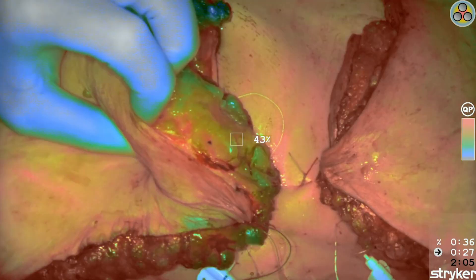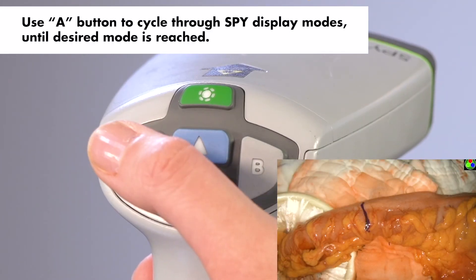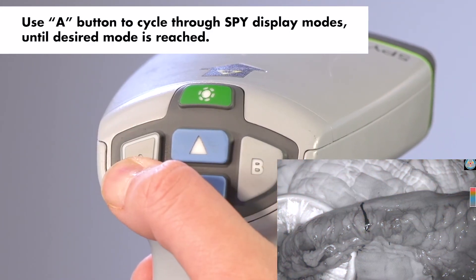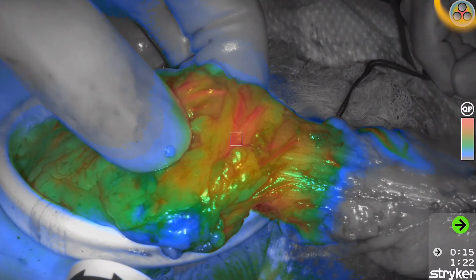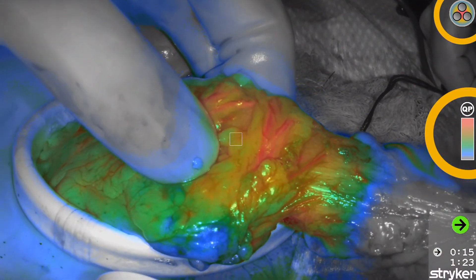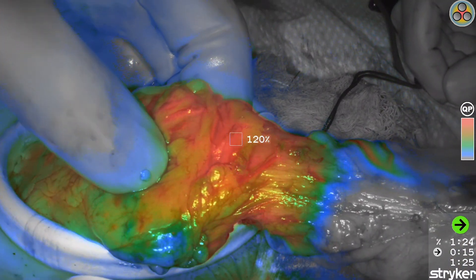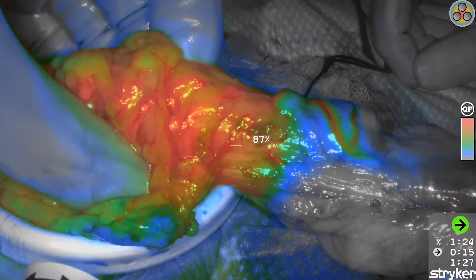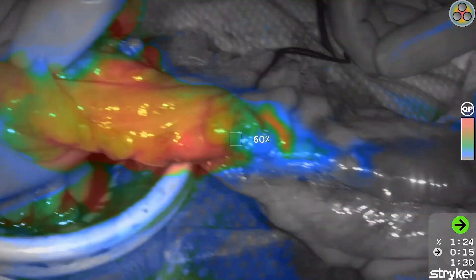Color Maps is another option to assess the fluorescence once the green arrow appears on screen. To access Color Maps, press the A button on SpyFi to cycle through the display modes until you see the Color Maps icon and Color Legend. Color Maps will display fluorescence intensity through a color map, with increasing intensities transitioning from blue to green to yellow to red.